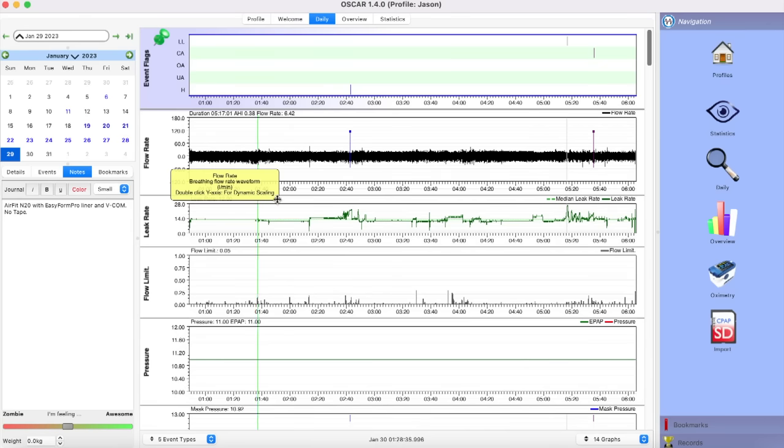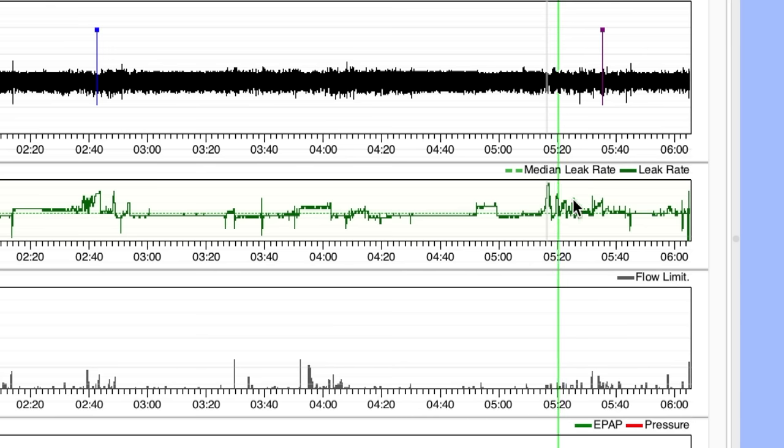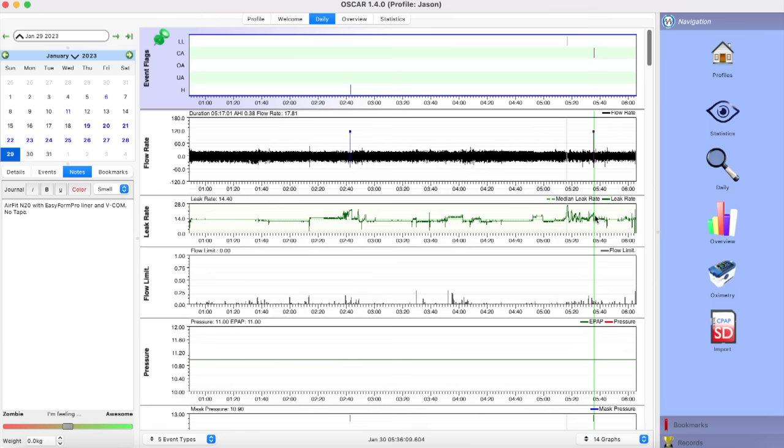Now let me show you a quick example of this from Oscar. This is me just the other night. I purposefully did not tape my mouth and you can see the results. There are tons of mouth leaks. Every time the leak rate increases in a jagged fashion like this, that is me opening my mouth and guaranteed every single time that's occurring, I'm waking up. And I'm waking up with a very dry mouth. Now, if I tape my mouth closed, that doesn't happen.